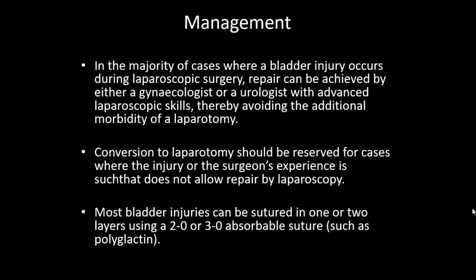Intraoperatively, the only options are cystoscopy and cystoureteroscopy. If the surgeon is not confident or cannot explore the ureters from the operative field, he will ask for a cystoureteroscopy. There is no place for taking an image during an intraoperative complication.